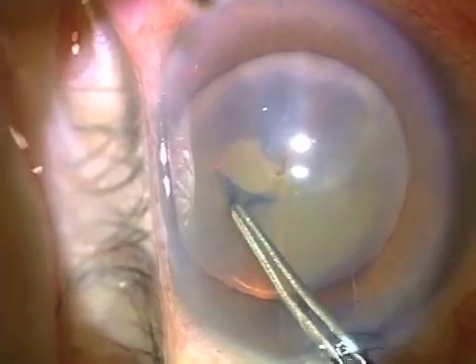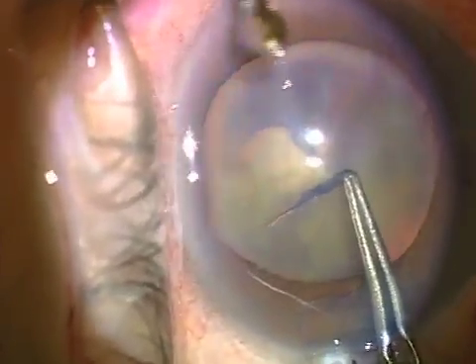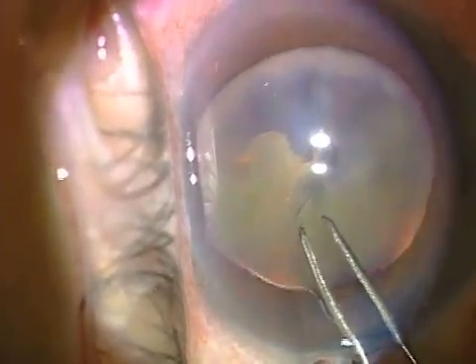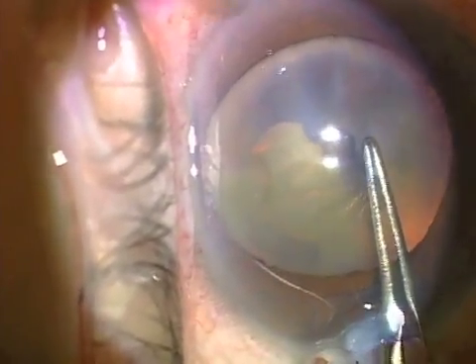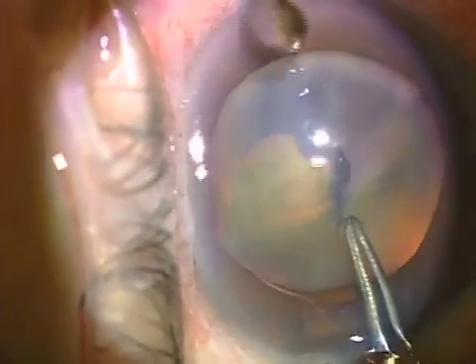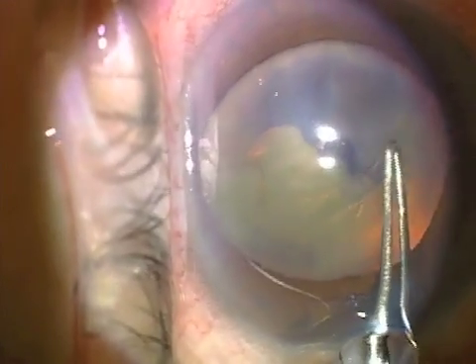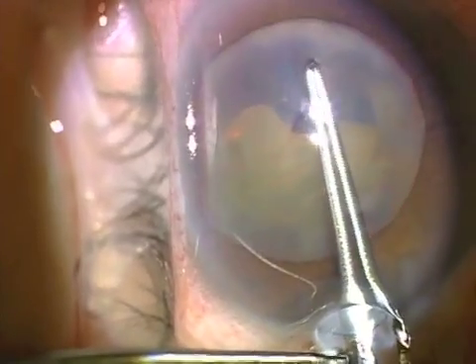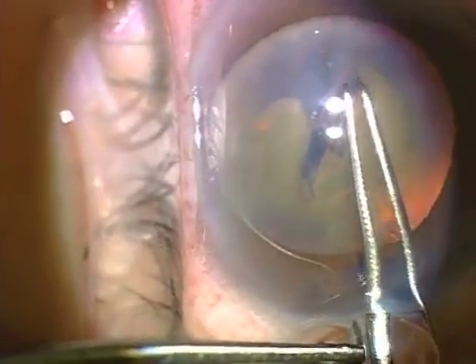You can see that I puncture and create a V to start the tear, and then continue as usual, stopping at the sub-incisional area to re-grasp, and then carrying on to complete the tear — moving the tip of the forceps in a direction different than the point of tearing, but to guide the tear in the desired diameter and direction.